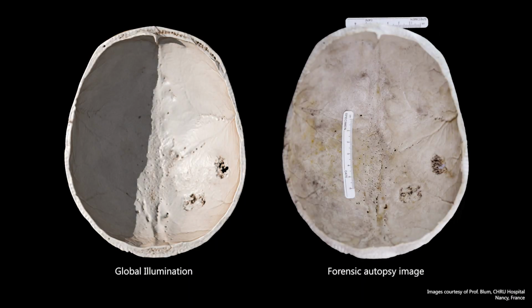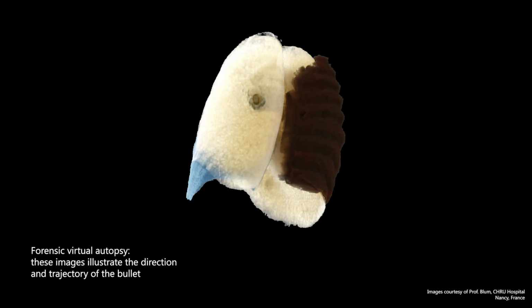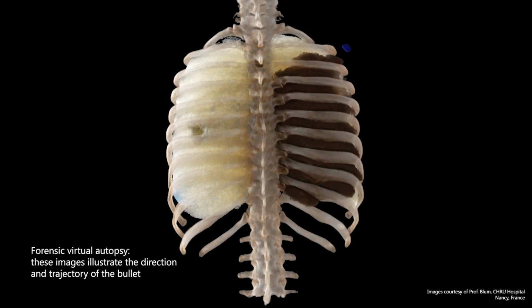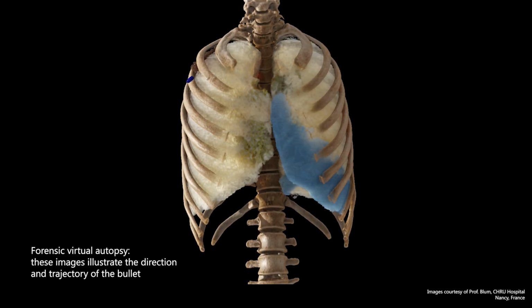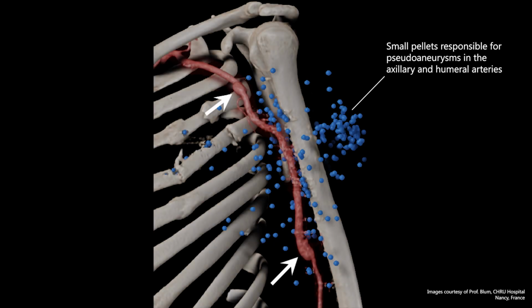Global illumination, I think, is a very useful tool to communicate with forensic guys, with the forensic department. Usually, the autopsy is based on our findings, and the more efficient we are, the more efficient they will be. And right now, they want post-mortem CT scan with global illumination in all cases. So we have to do it in all cases right now.